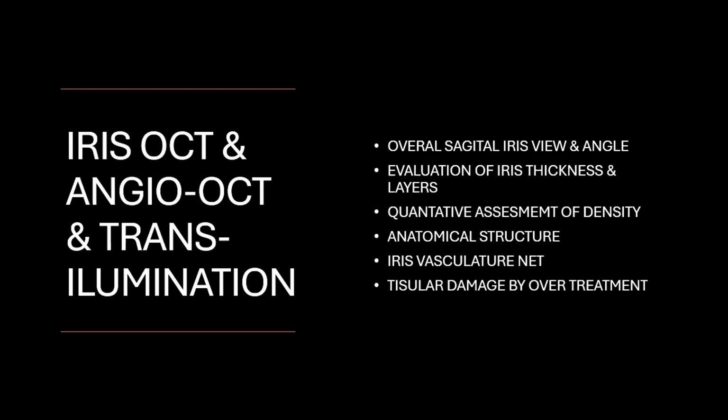With the aim of ensuring the anatomical and structural integrity of the iris, we have incorporated 3 techniques: OCT, angio-OCT, and transillumination. With these, we can obtain a sagittal view of the iris. We can take measurements of the total thickness of each layer of the iris, quantitatively assess the density of the posterior pigmented layer, the stroma, and the anterior pigmented epithelium, and thus have a clear idea of the anatomical integrity of the iris.